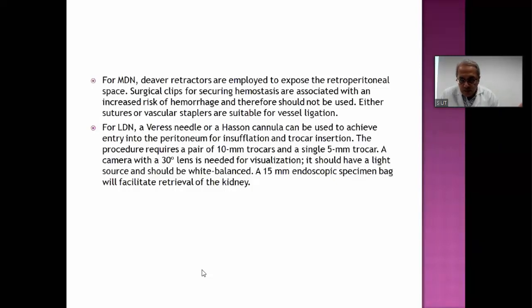The second method is laparoscopy. Now, the method of doing laparoscopy employed here in SIUT is a little different from what you can see on this slide. For instance, starting from the lens, we use a 0-degree lens. It's not 30-degree, because we have been trained by our seniors to do it with a 0-degree lens, and we can have it with a 30-degree lens, but there is a little bit of adjustment in orientation, and there is an advantage for 0 as well as for 30.